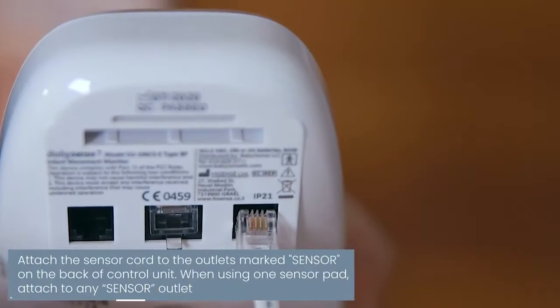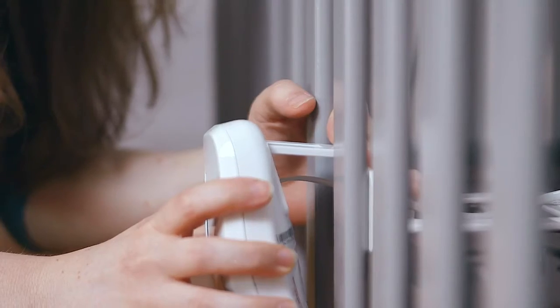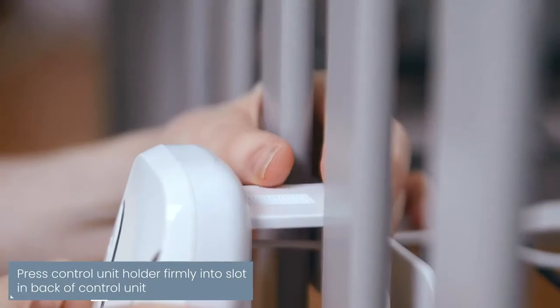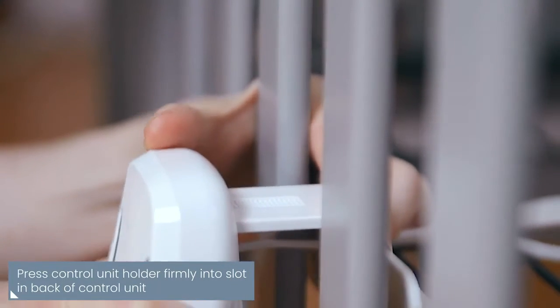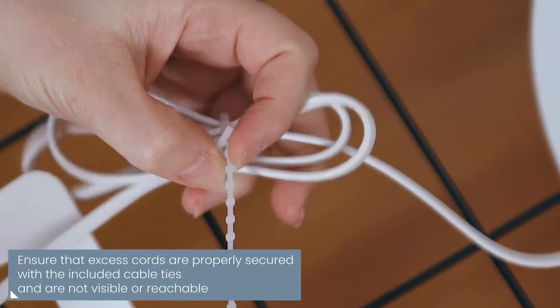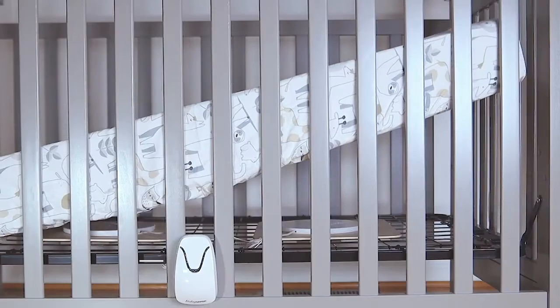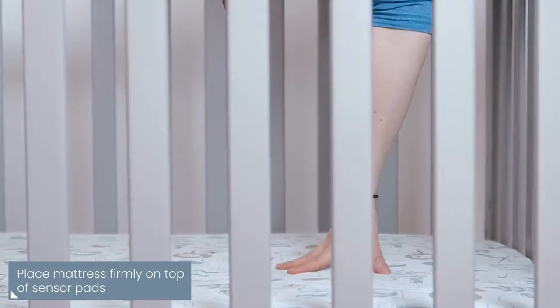Attach the sensor cord to the outlet marked 'sensor' on the back of the control unit. Press the control unit holder or hanging hook firmly into a slot in the back of the control unit. Ensure that excess cords are properly secured with the included cable ties so your baby can't reach them. Place the mattress firmly on top of the sensor pads, ensuring good contact between the sensors and the mattress.